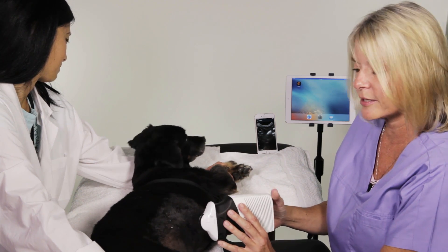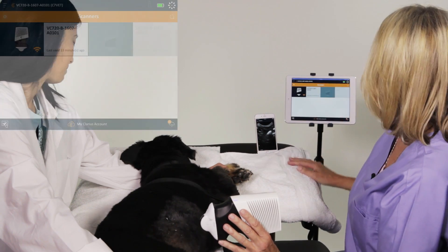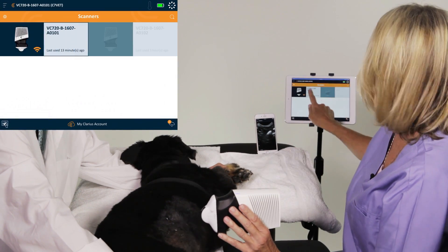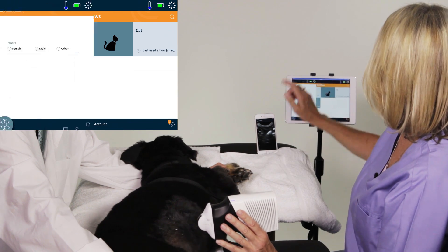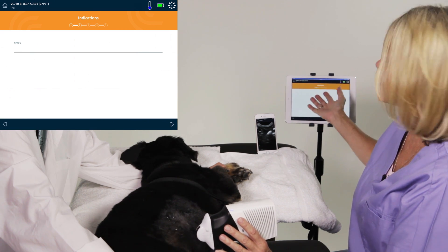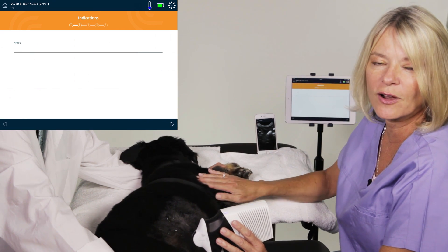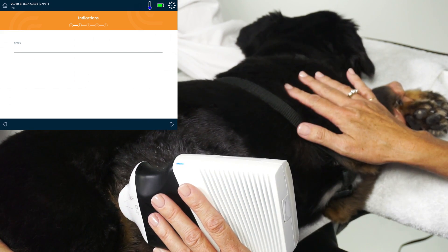Now I'm going to show you how to scan using the Clarius scanner. We just select our app, we select which scanner we're using, and then we pick our application. This is where you put the patient's information in, and on this page you can put the information regarding the pet specifically, whether it's medication or previous diagnoses.